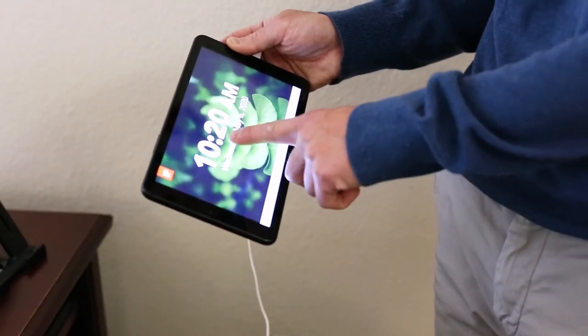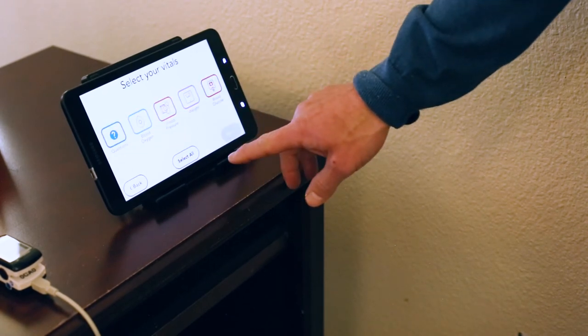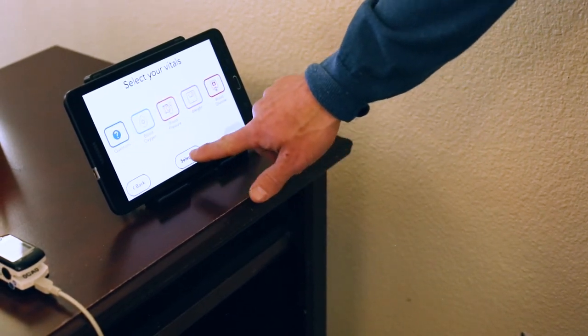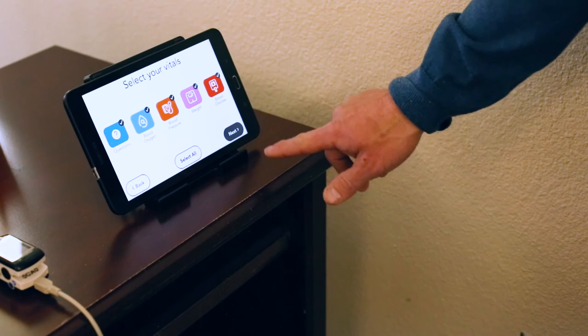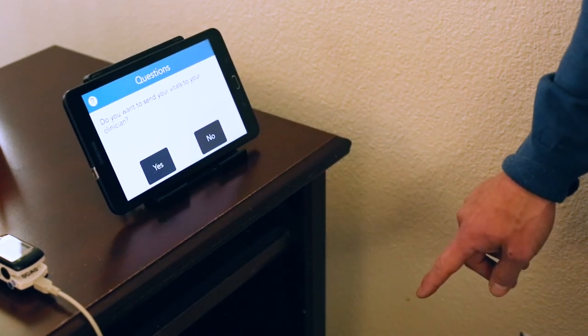Now that the equipment is all set up, we will begin taking our vitals. The monitor screen is a touch screen. Tap anywhere on the screen, then select the 'Vitals Now' button in the middle of the screen and hit the 'Select All' button. Click Next. The monitor will walk you through the process of testing your vitals.